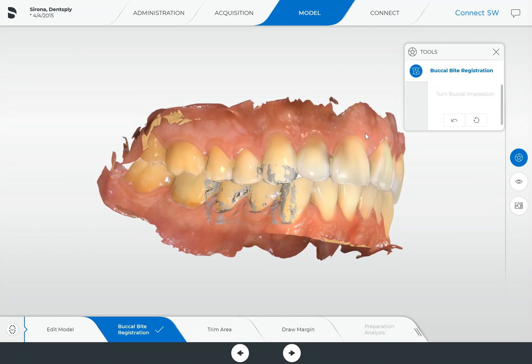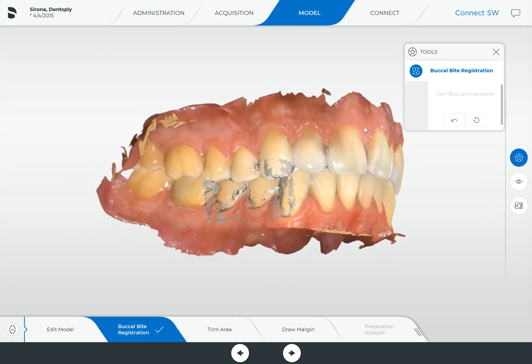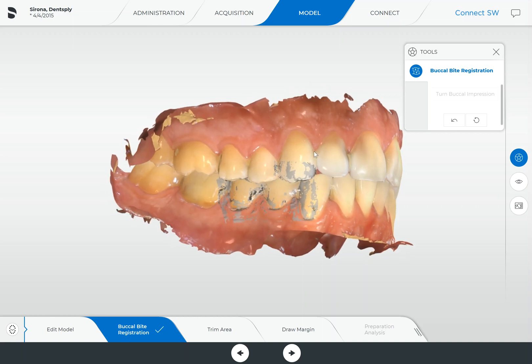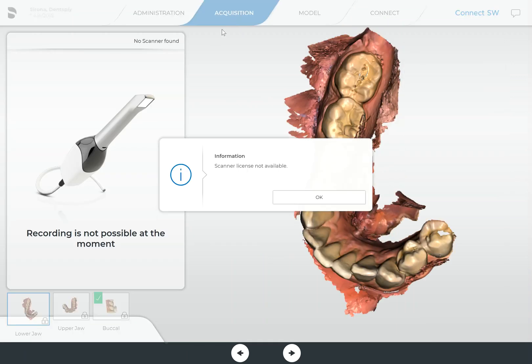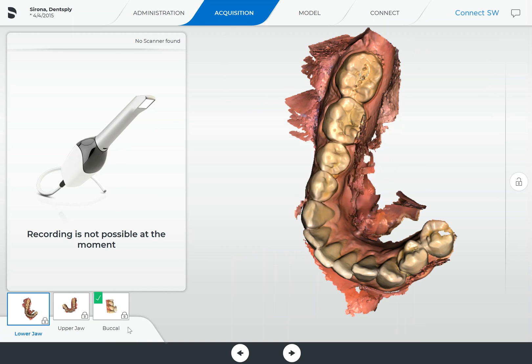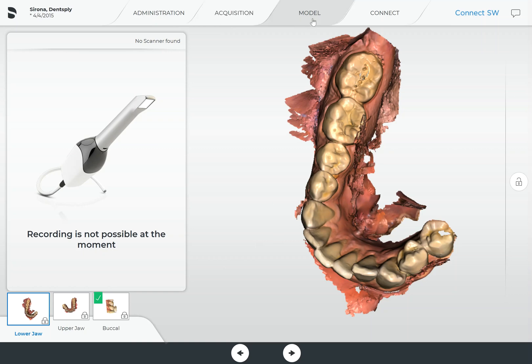So I hope this helps — that is the way you do a manual buccal bite registration. I just want to reinforce that in order to eliminate this, because it can be time consuming or a bit tedious at times, under your acquisition tab you want to make sure that the buccal bite catalog has a green checkmark. It has a green checkmark now because we went and did the manual buccal bite registration. But when we were scanning, if we didn't have this green checkmark before we proceeded to the model tab, it would ask us to do the manual correlation that we had to do back here over our model.